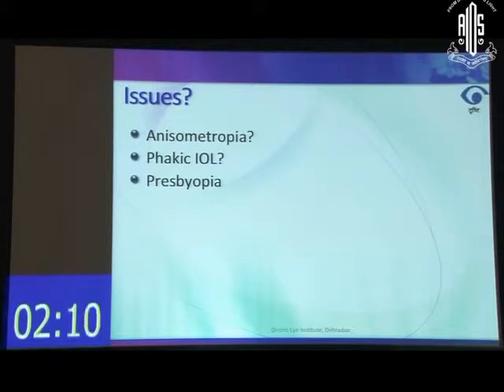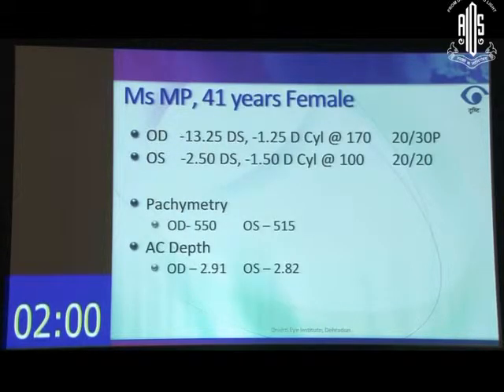You can think of LASIK in one and ICL in the other. So you would do LASIK in the right eye or ICL in the right eye? Where your depth was higher, okay, so 2.90. So in the eye which has 13 diopters of correction, you would choose an ICL. Now also you have to see that this patient is already 41. So typically what's your cutoff for ICL?